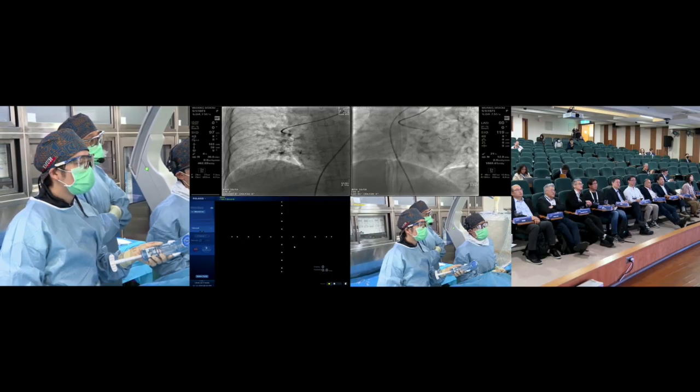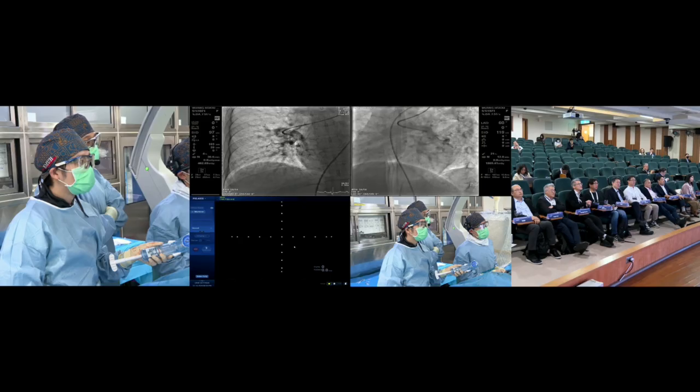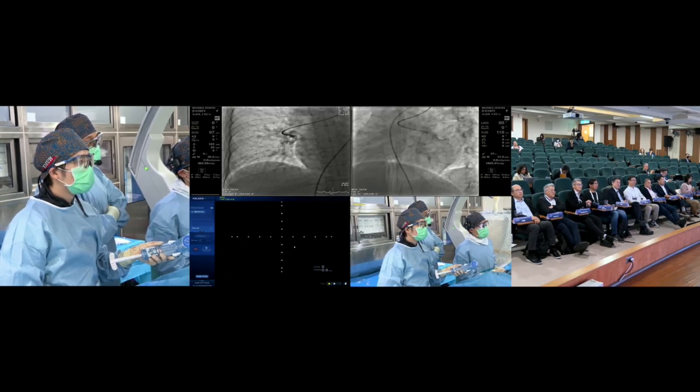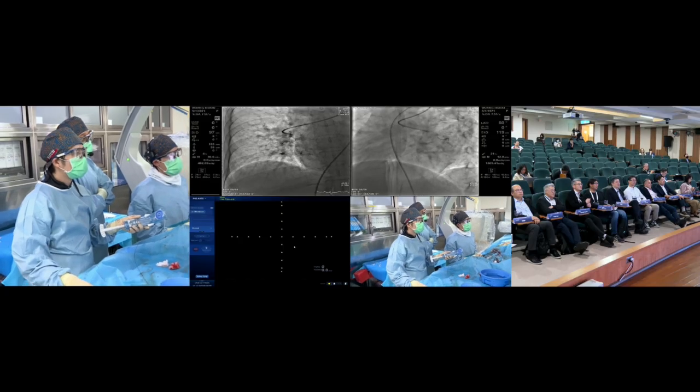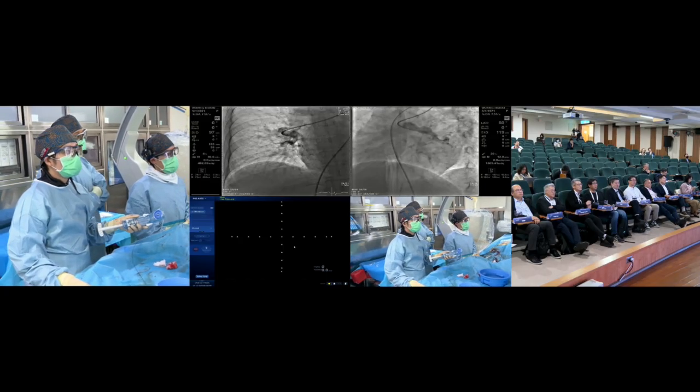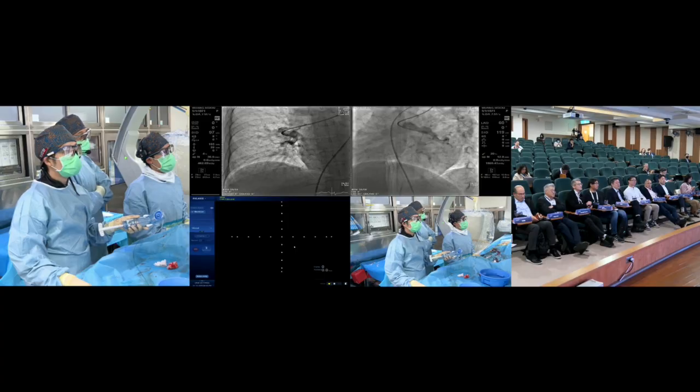Okay. I think probably for now we just leave the patient. We won't target the upper lung lesion this time because there's a chronic total occlusive blunt-ended lesion. Because the pressure right now is too high, I think it's too risky to target this kind of total occlusion lesion.